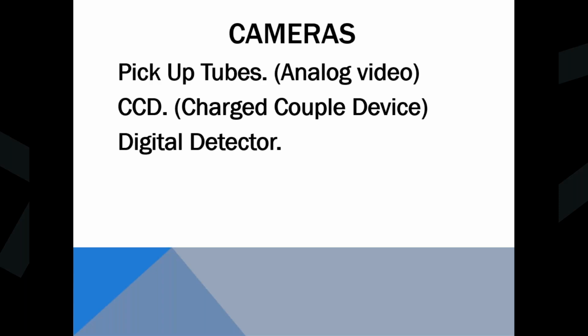And then the next one is your digital detector, and it's what they currently use. So the digital detector takes X-ray, converts it to light, and then converts it to a digital image, and then sends it over to the image processor. So it's 110% digital. The image is available instantaneously. So as they're going through the case and say they're in the heart, what they see on the screen is actually what's going on in the patient.